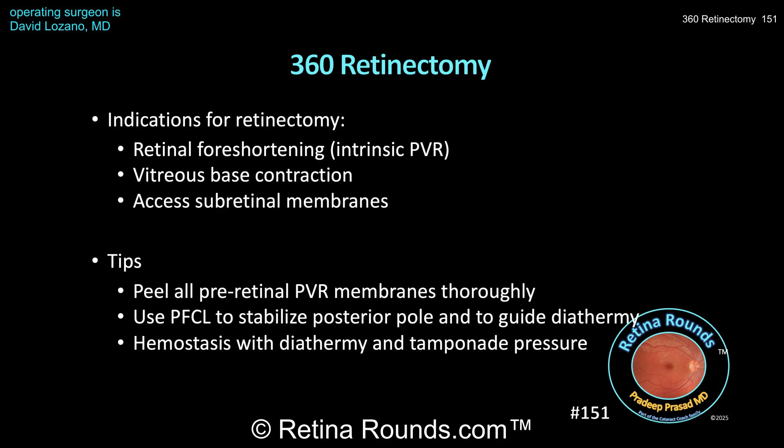To recap some tips when performing a retinectomy: number one, remember to peel all pre-retinal PVR membranes thoroughly before creating the retinectomy edge. Two, perfluorocarbon liquid can be very helpful to stabilize the posterior pole when creating a retinectomy, and the circular edge of the PFCL can help guide where you apply diathermy and create the retinectomy. Bleeding can occur when creating a retinectomy, and hemostasis can be achieved with diathermy and using tamponade pressure. Finally, be careful to avoid iatrogenic trauma to the RPE and choroid. In some cases you may need to aspirate up the anterior edge of the retina to create enough space to introduce the cutter and create the retinectomy.